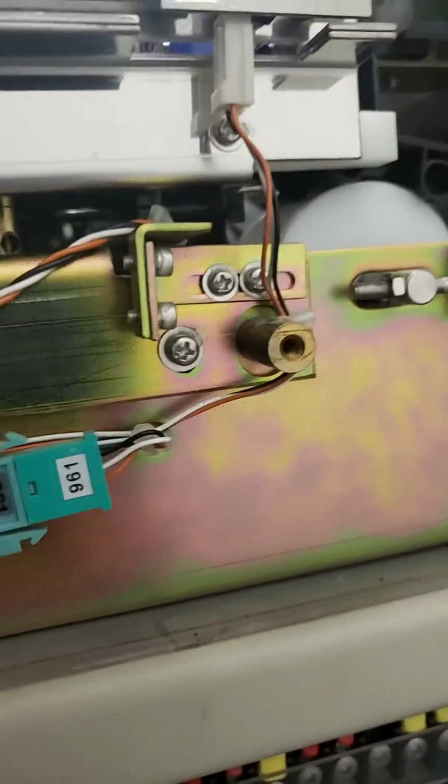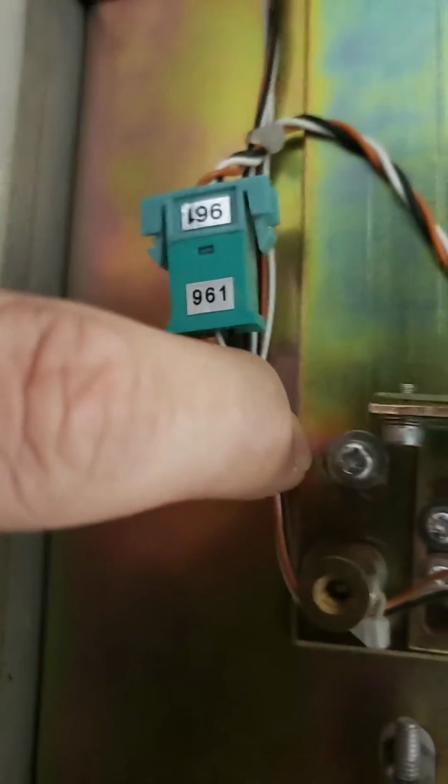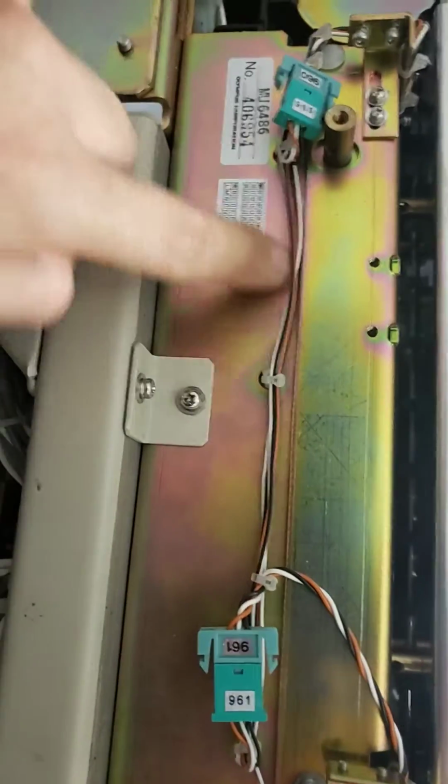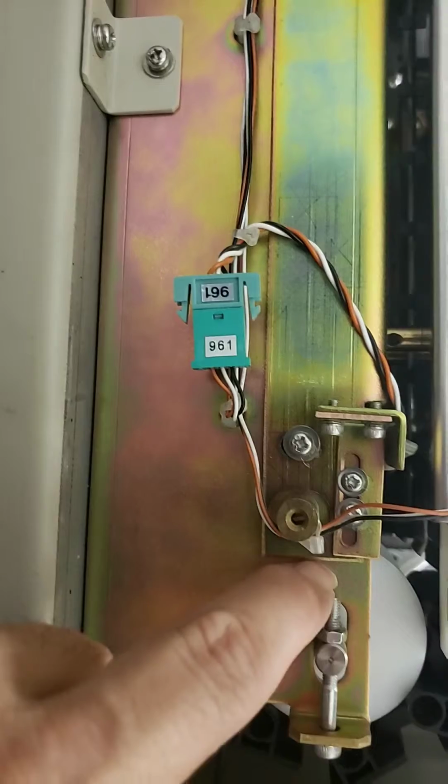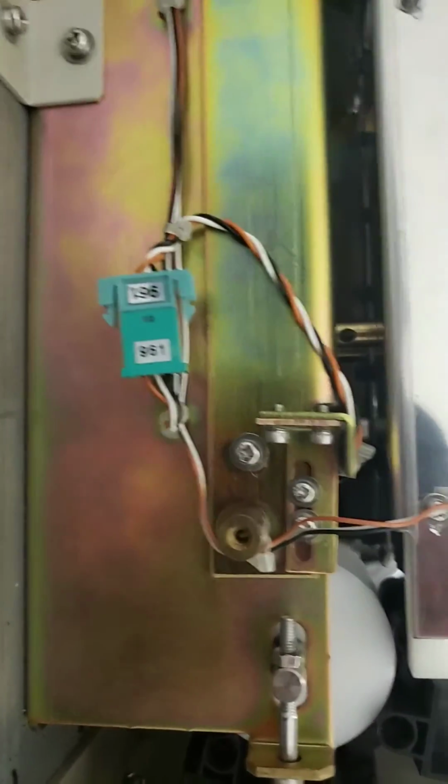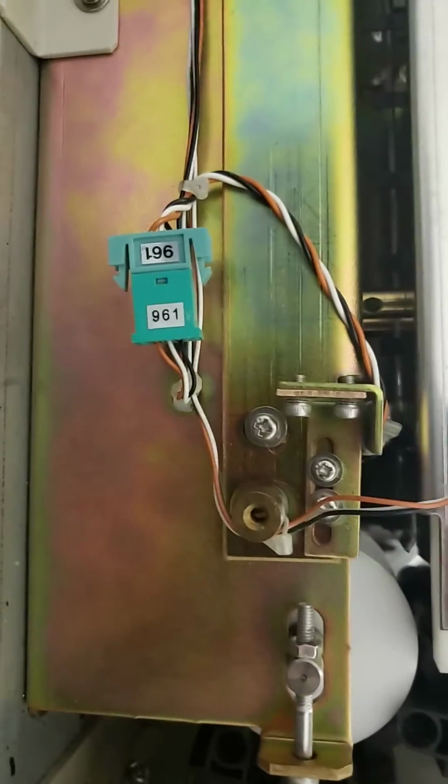So we have the screws down here on both sides. Now normally what I do is I like to etch it. Alright, sorry. So I'll go ahead and etch it right here. So the bottom of this plate, you just want to make a line across the bottom of this whole plate here, just so if you want to come back to the point you were at. So if you do move it up and down, you can kind of go back to your reference point.